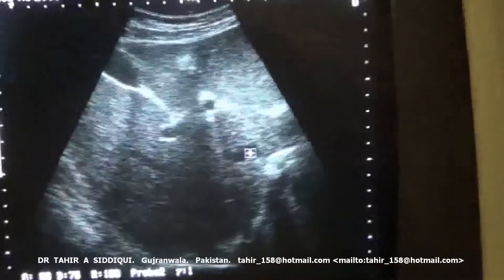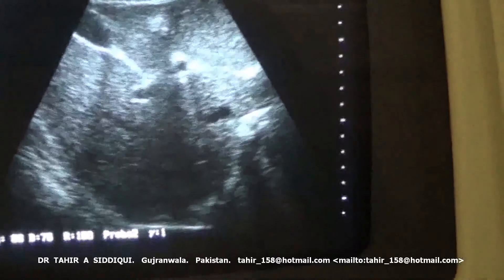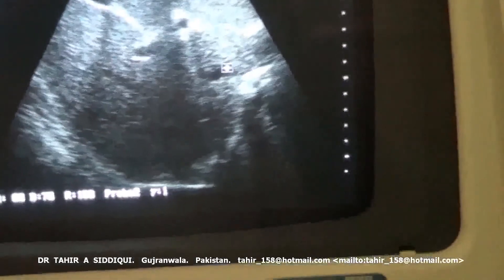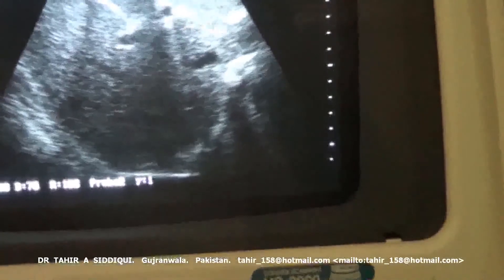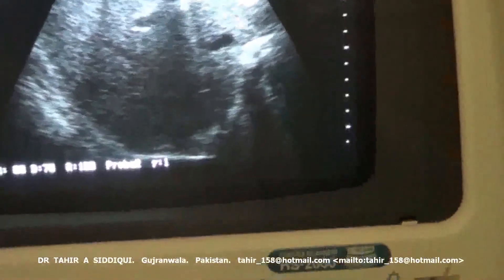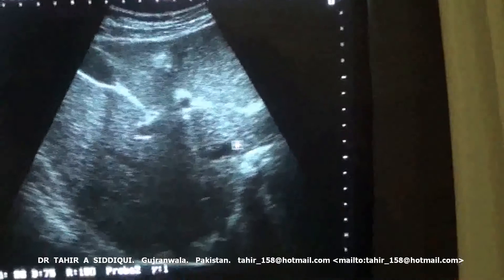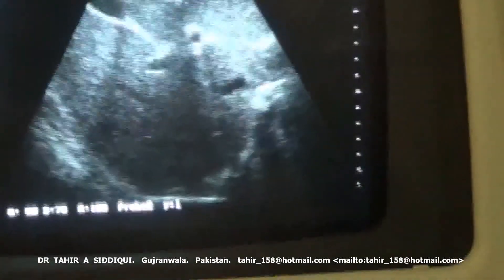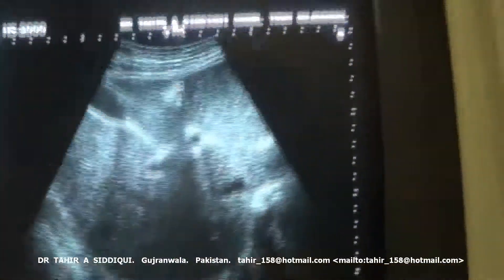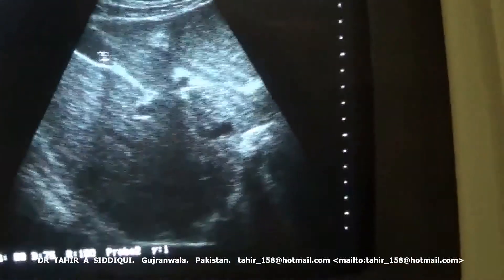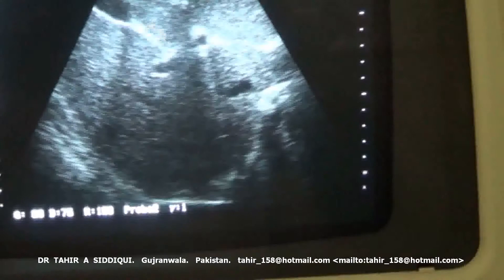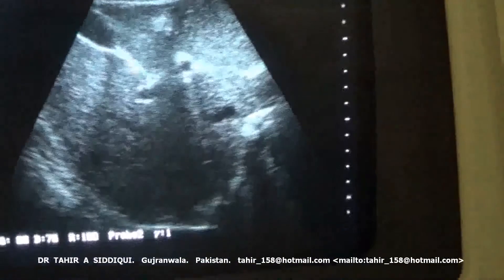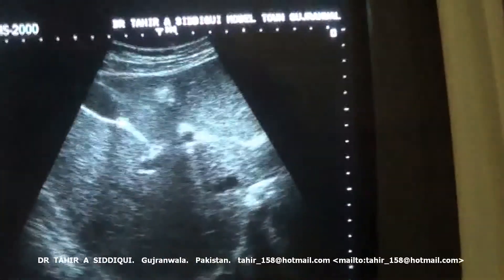The area bounded by the ligamentum venosum and IVC is the caudate lobe of the liver. This is the caudate lobe — segment one of the liver — in transverse section. This is the ligamentum teres in transverse section. This is the median lobar fissure.